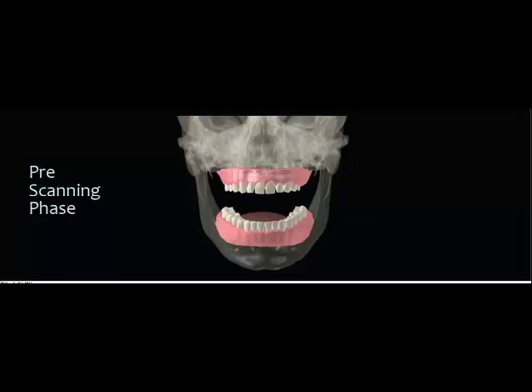So now that we have our radiographic template, our patient's going to be ready. We want to try it in our patient's mouth to make sure they're ready to have this fit prior to the CT scan. So we reassemble this radiographic template in the patient's mouth. And a very important step is placing our putty index. The putty index is fit to make sure the soft tissue and the guide are positioned in a repeatable manner, so it's well fit.